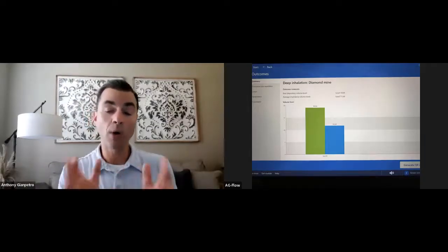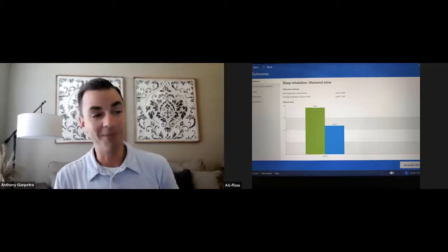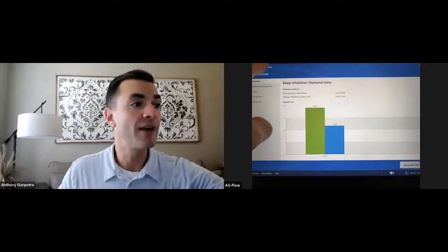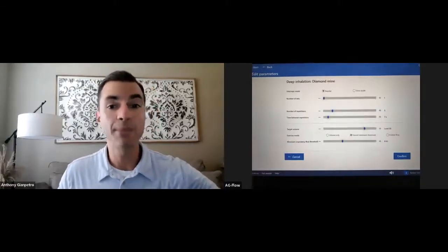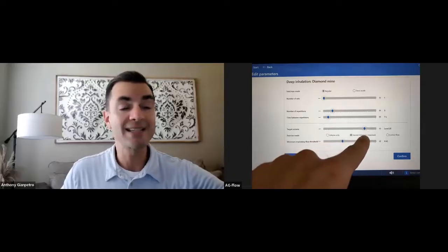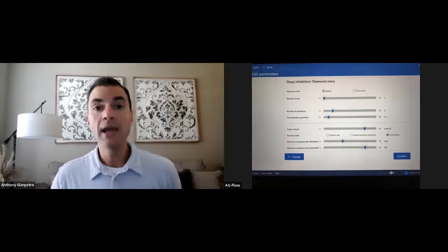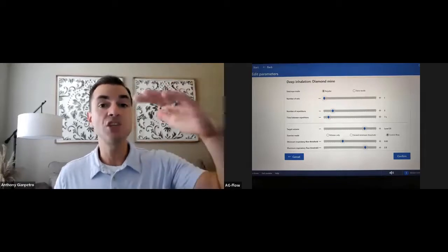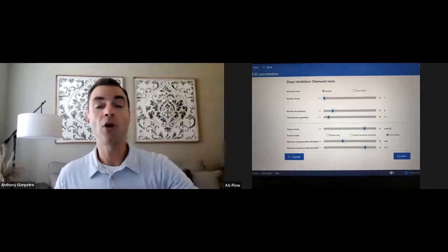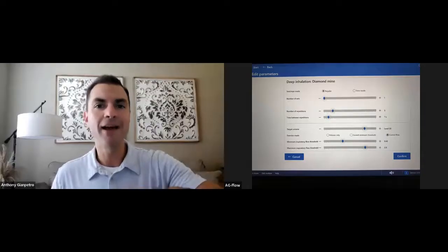The best way to do it, meaning with OmniFlow's virtual reality, the best way to do it and the hardest way to do it, I'm going to go back to the OmniFlow presentation here. If I go back and take you to the edit parameters, notice that we did volume only. We just did exceed minimal threshold with that stalactite. Now we have control flow. And control flow means it's not just that you have to overcome the minimum, for the stalactite at the top. We're also going to build a stalagmite on the ground, which, think of that G as ground, right?